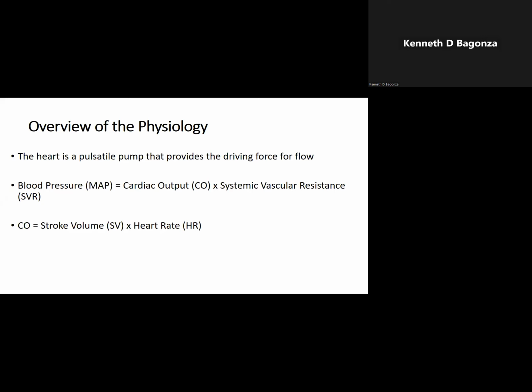And in circulation, remember that we've said that arrhythmias are essentially affecting the heart, so this would be mostly a circulation problem. In circulation, you try and find out, is there adequate perfusion? And if there's no adequate perfusion, what can I do about it? But also, number two, you attach ECG leads to make a diagnosis. Is it a bradyarrhythmia? Is it a tachyarrhythmia? And what type of arrhythmia is it? Based on the presentation that was made just before this.